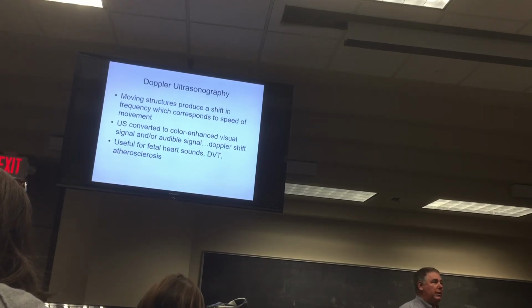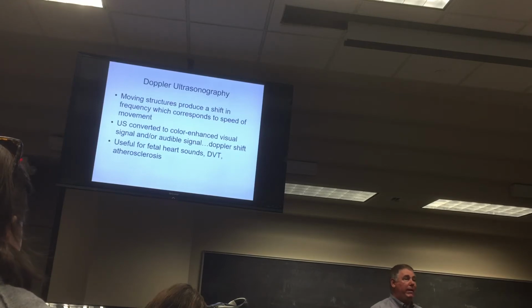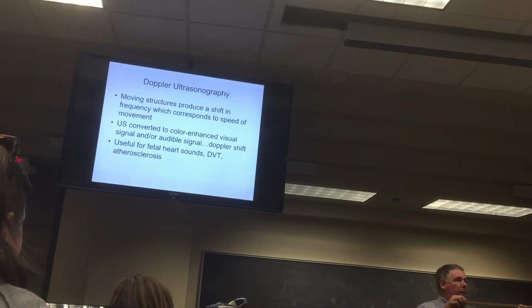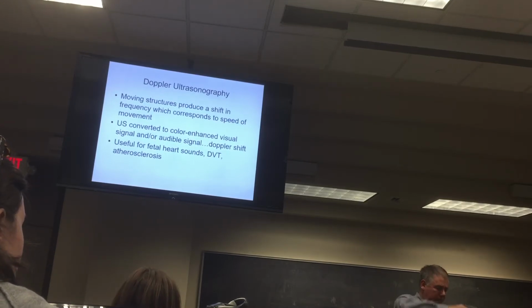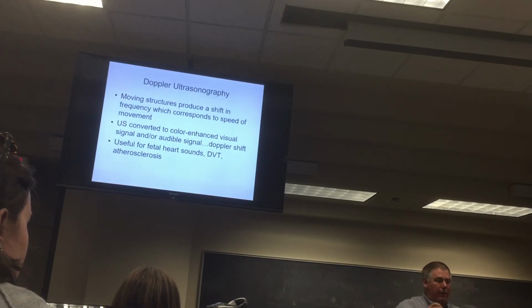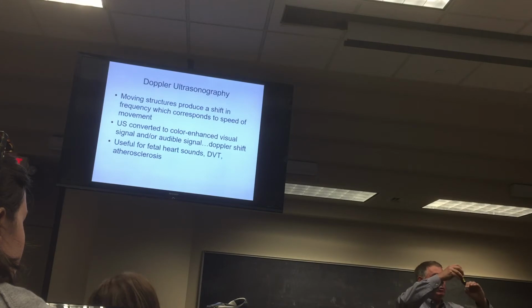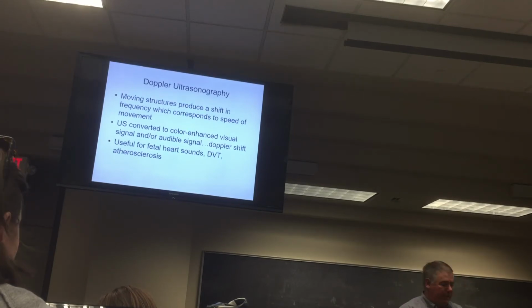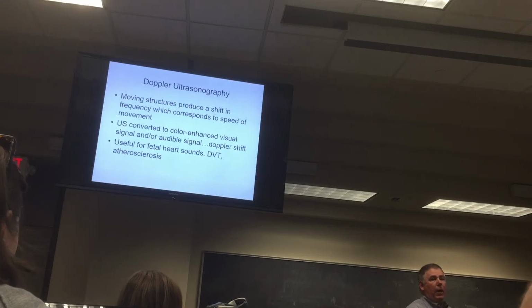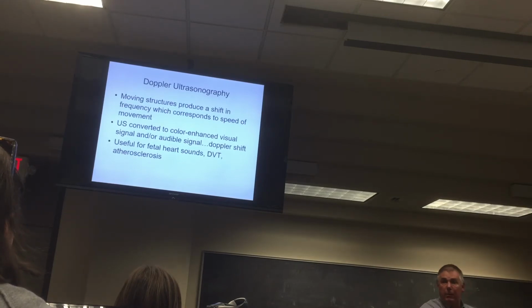Okay? We do Doppler ultrasounds all the time of the lower extremities looking for DVTs. And one thing you're going to do is check whether or not it's compressible. If you have an artery and you push down on it with the probe, an artery has such a thick muscle wall, it doesn't compress, it just moves. A vein, on the other hand, if you compress it, you'll actually squish it. So if you're doing a Doppler ultrasound looking for a DVT, the report will come back that the veins are clear, compressible, which means that they're open. If they're not compressible, that means they're full of clot. Okay.